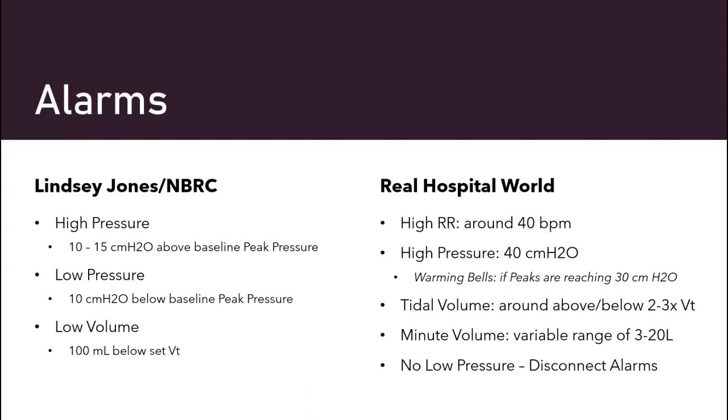Your tidal volume alarm, around 2 to 3 times above and below. Your minute volume, 3 to 20 liters, and then we don't have a low pressure alarm, we just have a disconnect alarm, which normally is around 20 seconds. So those are alarms.